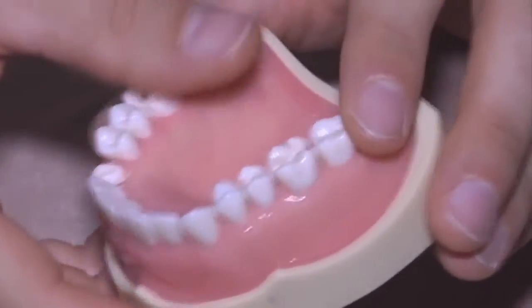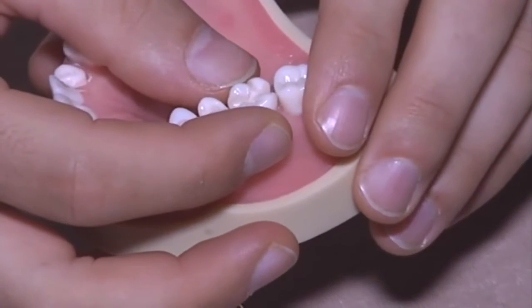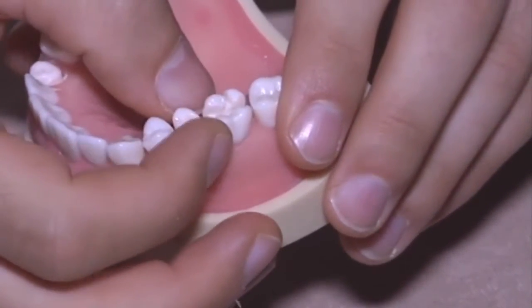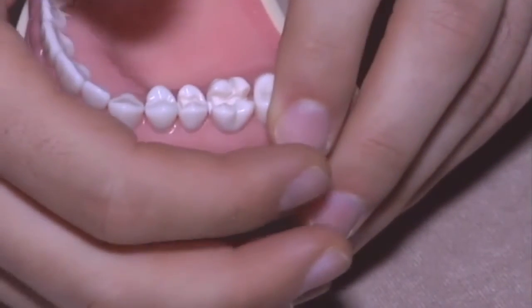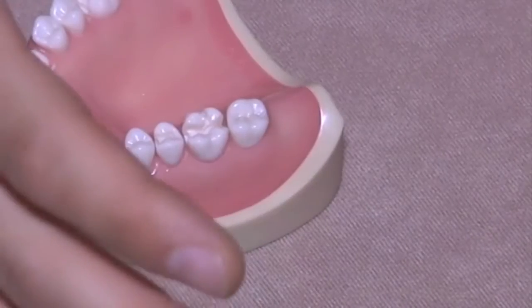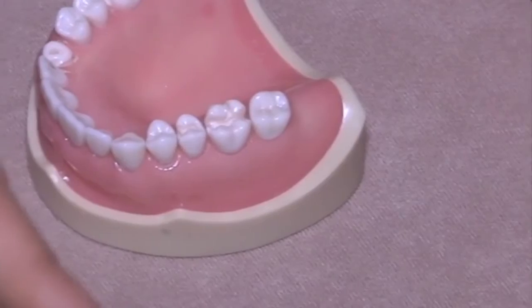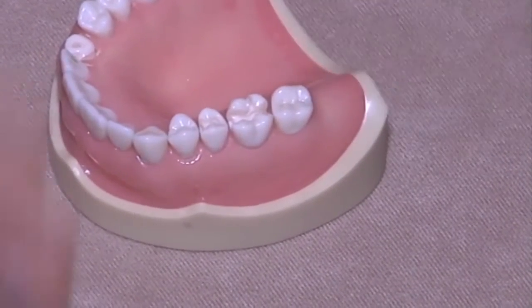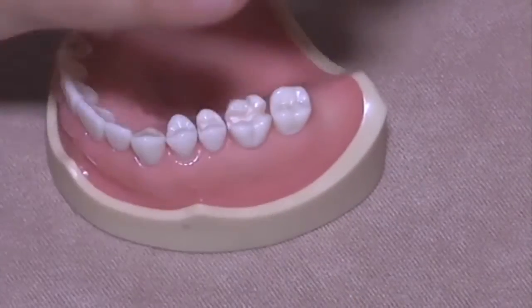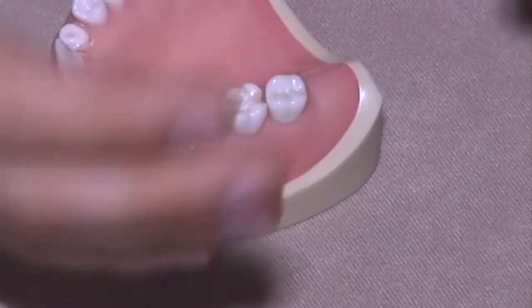Usually in these very common cases, I used to perform a centripetal build-up technique. The centripetal build-up technique means that once you prepare the cavity, the first step is to transform the second class into a first class, building up the interproximal wall. There are several reasons for doing that.